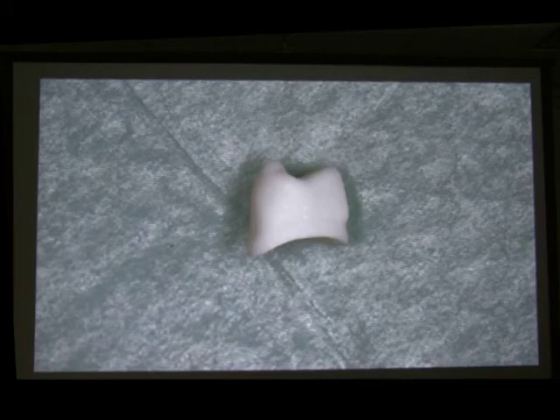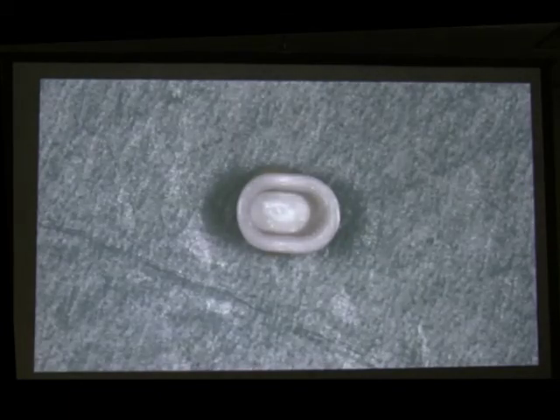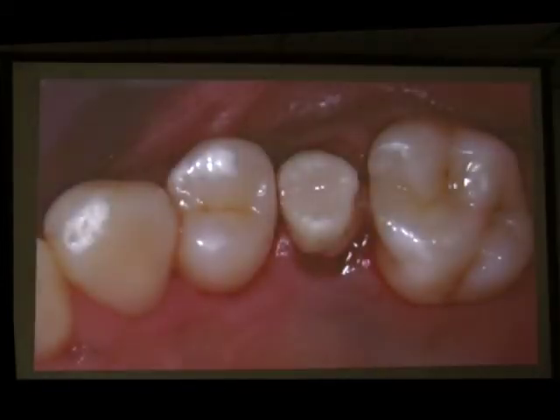Again, when we think that the tissues will be stable, we can use a coping, and on the day of surgery we can take impressions. If we have impressions, it doesn't mean we have to do the crown the same day. We can have the impressions done, but do not start doing the crown until we see the patient. So it avoids us having to put anesthesia just for the impression technique.